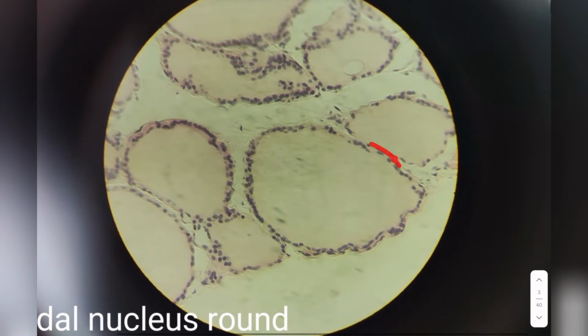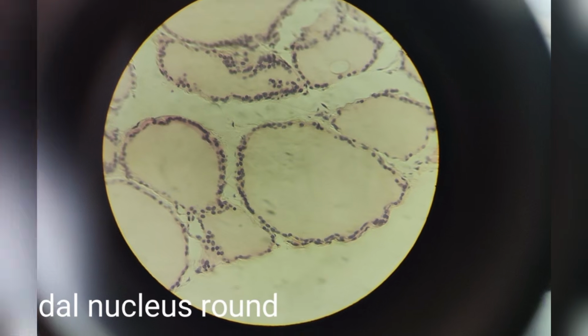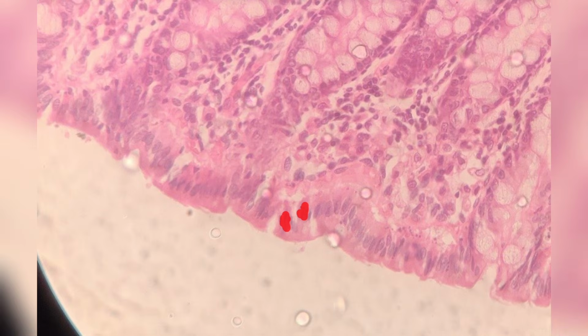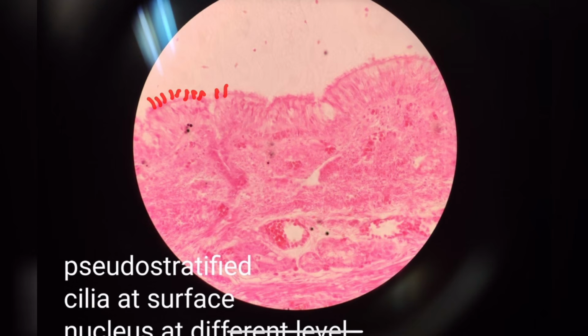Second, you can find these follicles. Lining these follicles, there are round cells. Round cells means cuboidal. These round cells are arranged in a single layer. So this is simple cuboidal epithelium. Next, you can find that there are elongated cells, pillar-like cells, and the elongated nucleus present inside them, and these nucleus are arranged in a single layer. So this is simple columnar epithelium. Next, you can find that there are cilia, and nucleus are present at two different levels or multiple levels. So this is pseudostratified epithelium.